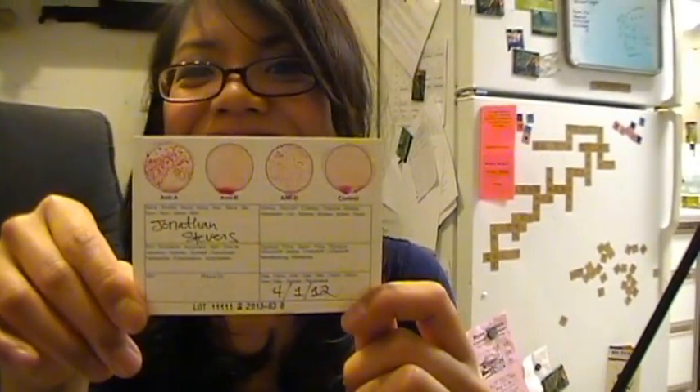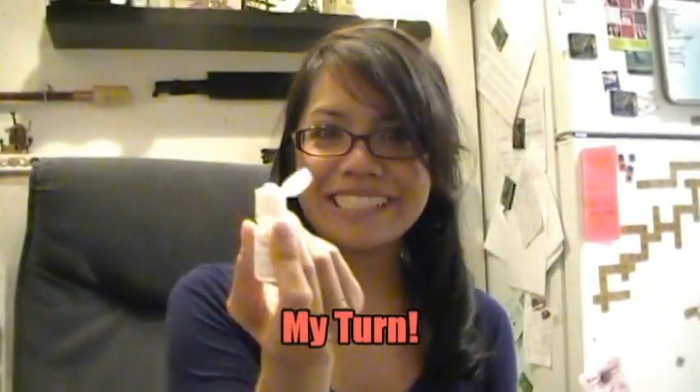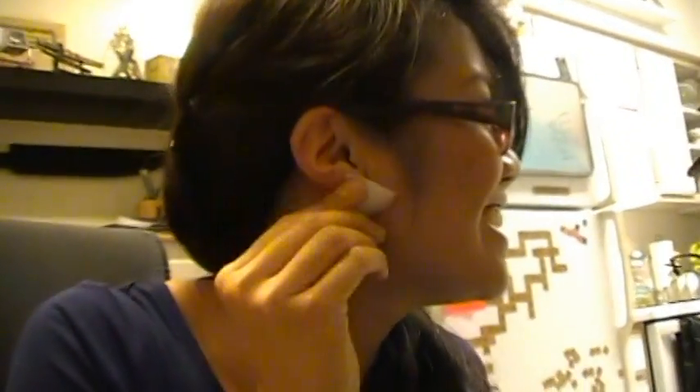Hooray. Ow. We're doing this again. One drop of water in each well. Now we're going to use my ear. I'm excited. Hell yeah. Now I get to laugh like a maniac right before I stick you with a piece of metal and make you bleed.